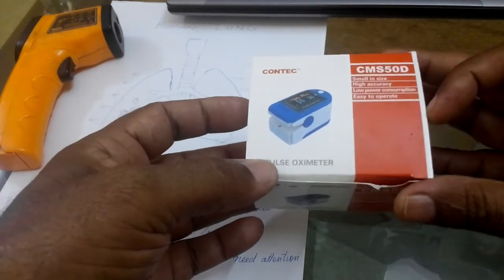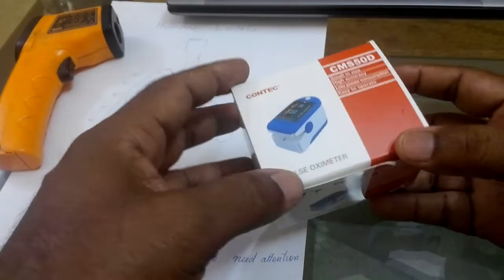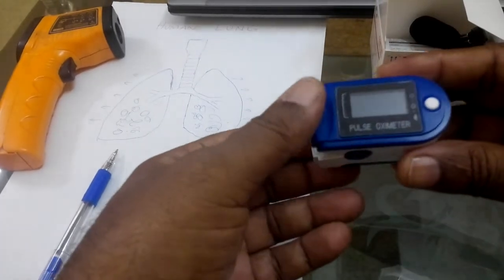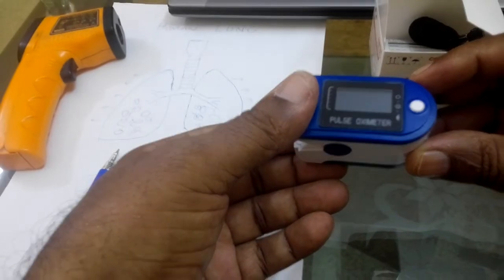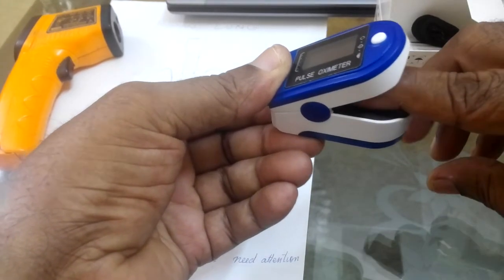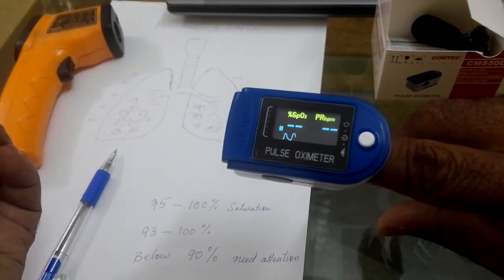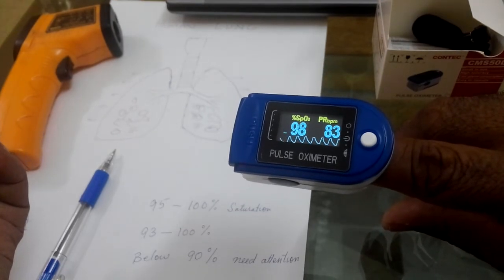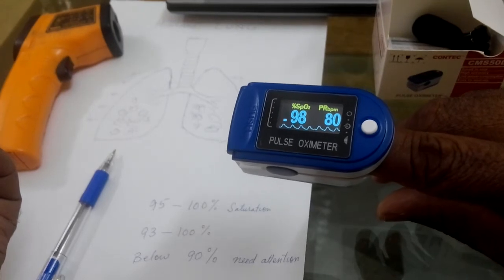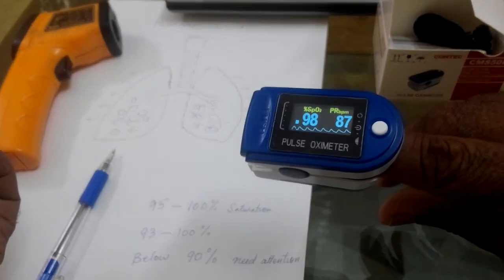It is sensing your blood oxygen level. Now I am going to check my blood oxygen reading. You can see it is showing my blood oxygen saturation at 98 percent and pulse rate at 83 to 84. Now I have to make sure whether this instrument is sensing correctly or not.